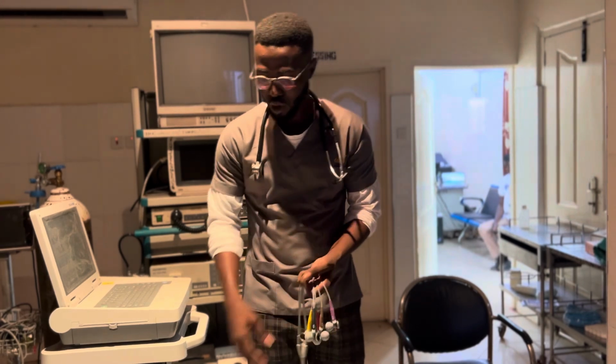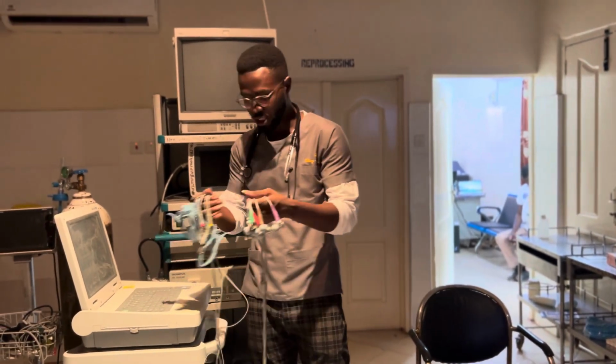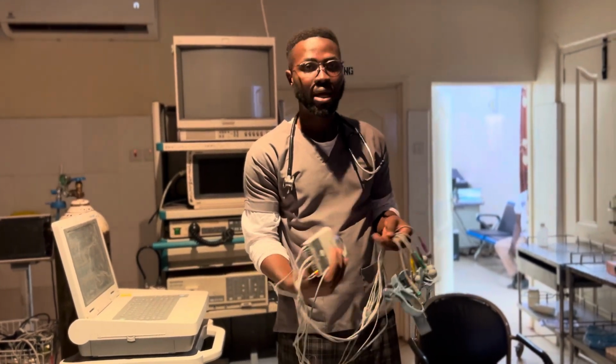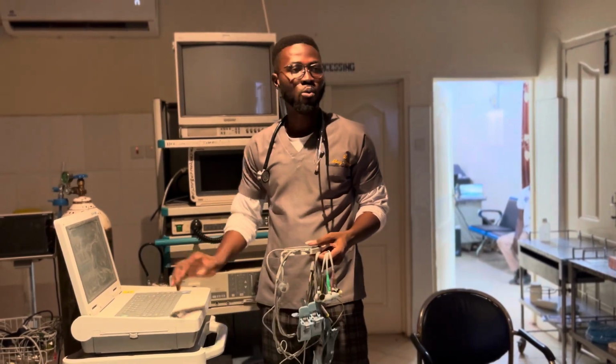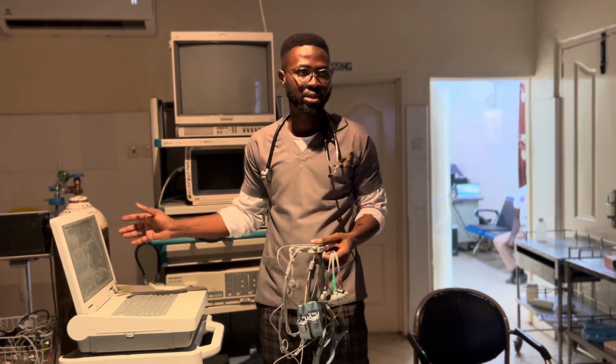All right. So assuming you've walked into a station and you've been asked to perform an ECG, and you see that all of them have been connected to the connector, and it has been connected to the ECG. So the ECG has been programmed, it has a stylus there, there are papers there, and once you put it there very well and press reading, it just starts reading, isn't it?